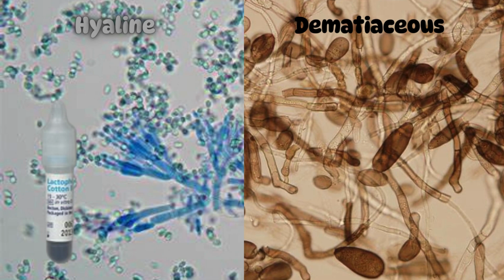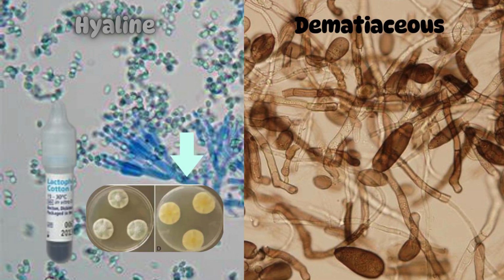On the plate, hyaline fungi have a white, pale beige or tan color on the backside of the agar plate or culture. When looking at the backside, you're actually looking at the hyphae. The color of the hyphae decides whether a mold falls under the hyaline or dematiaceous group. These two groups account for the majority of molds recovered in clinical cultures of patients. For this video, we will focus on hyaline fungi.